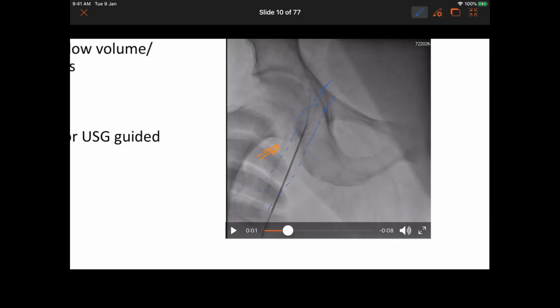So the orientation of the sheath starts along the venous puncture. What could have happened is that the interventionist here has gone in with the needle and may have hit something, may have thought that it's not a good spot, and may have gone slightly laterally and hit an artery.